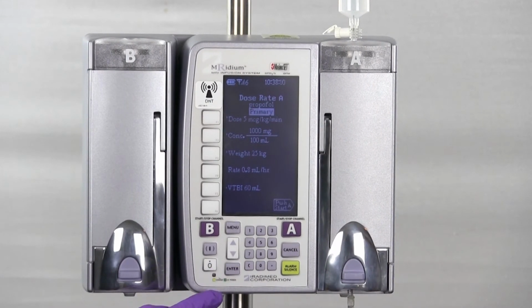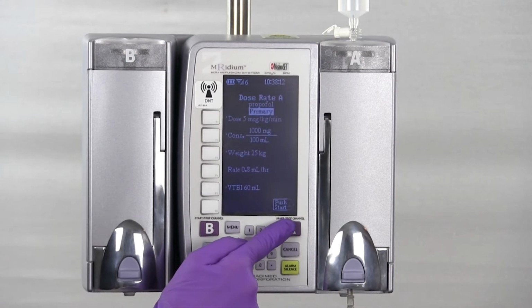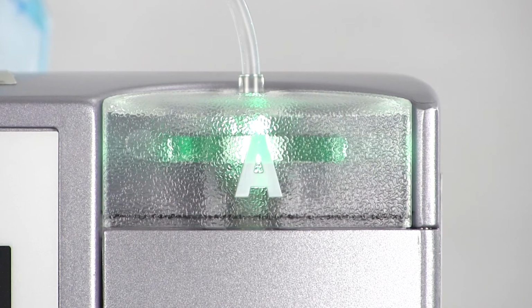Push Start A will appear on the pump screen in the bottom right corner. The user will press the Start Channel A button to begin the infusion. The status light will flash green, which indicates the pump is infusing.